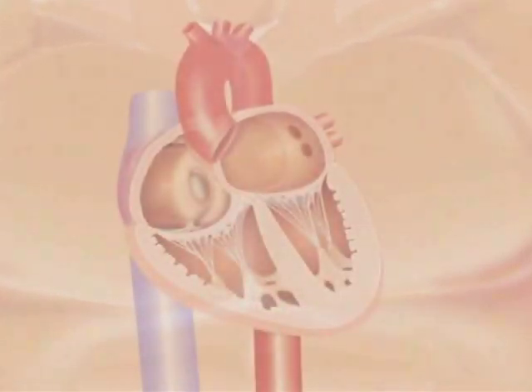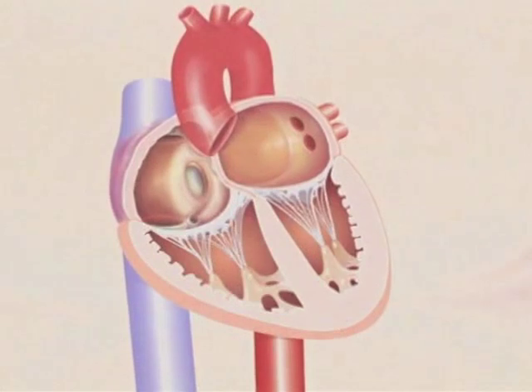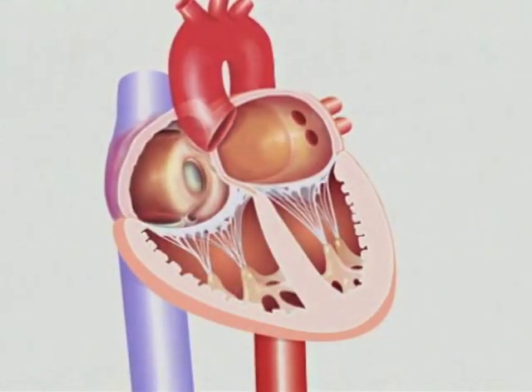Use a standard transseptal puncture technique to gain access to the left atrium from the femoral vein. Introduce the guide wire through the needle and into the left atrium. Then remove the transseptal needle and Mullins sheath.